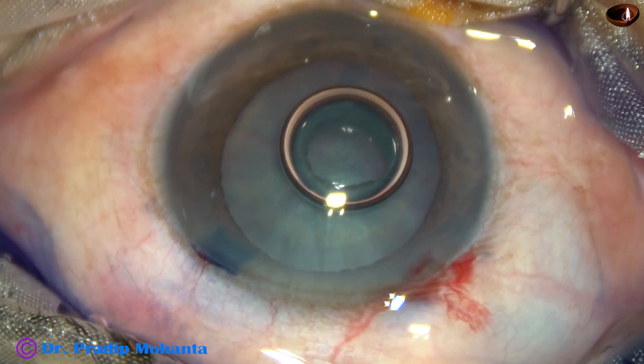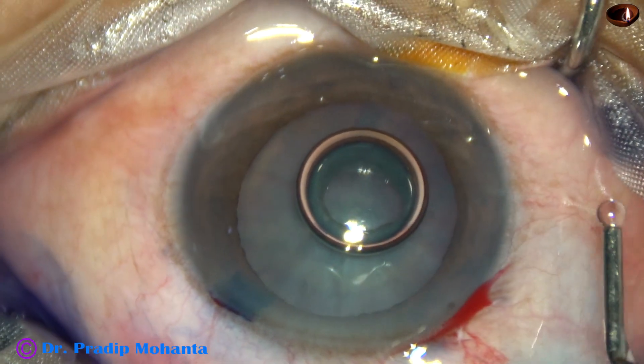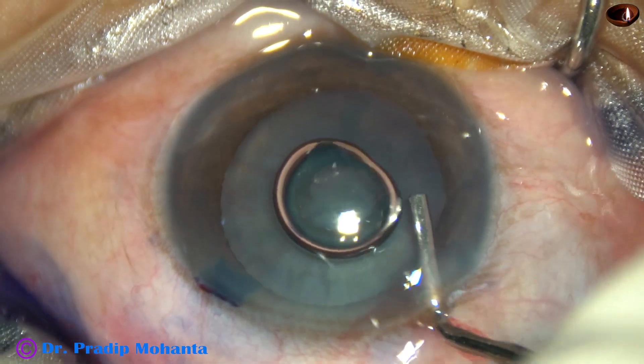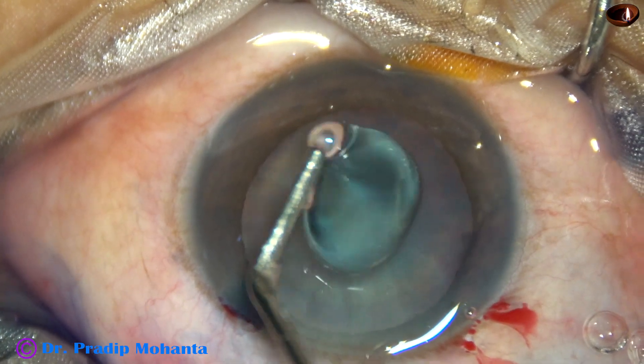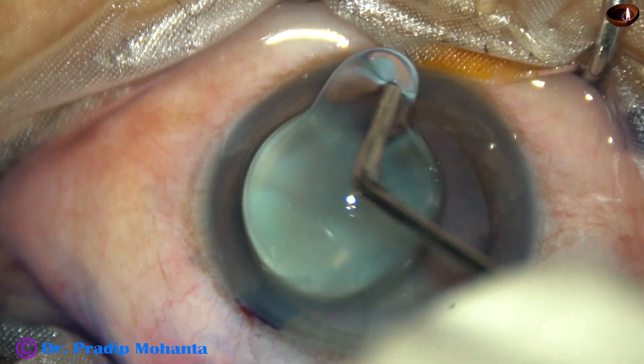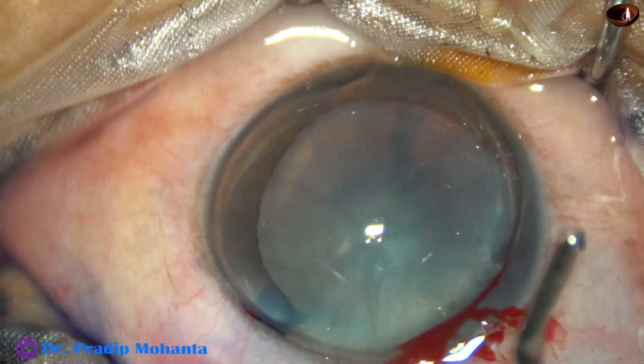The anterior chamber is filled up with 2% hydroxypropyl methylcellulose. Methylcellulose is also applied over the cornea for better visibility.